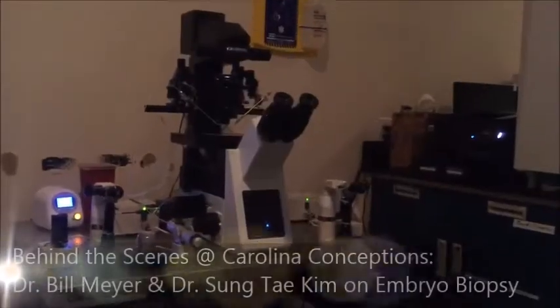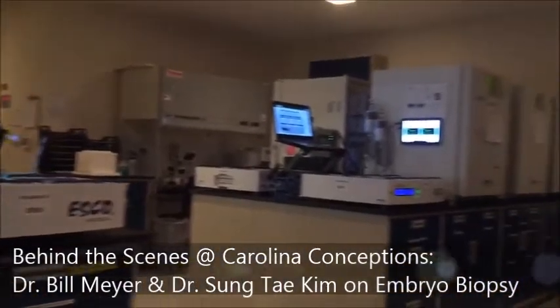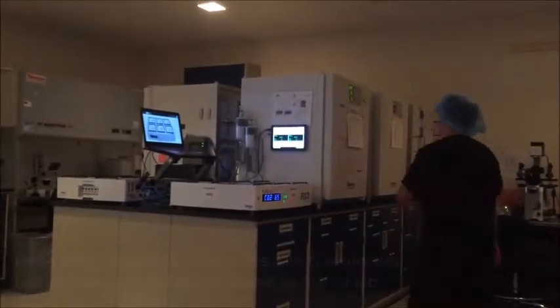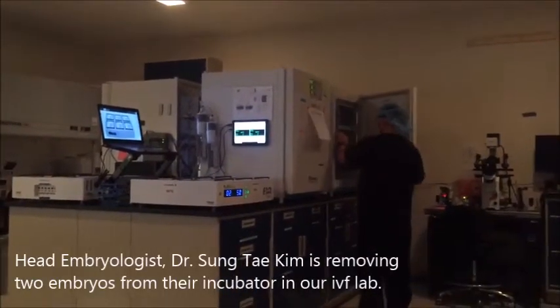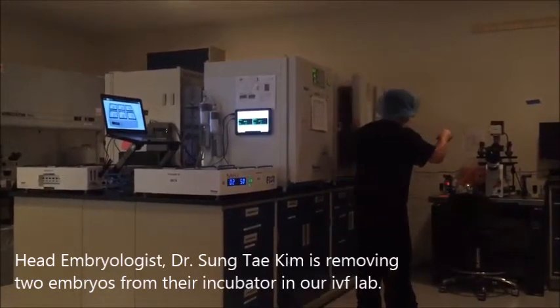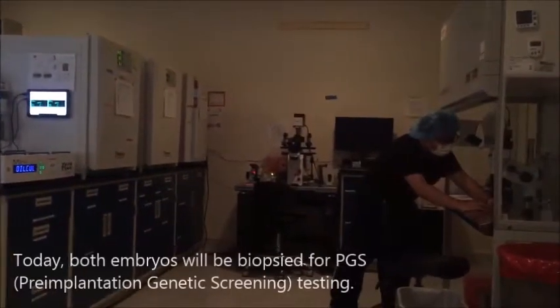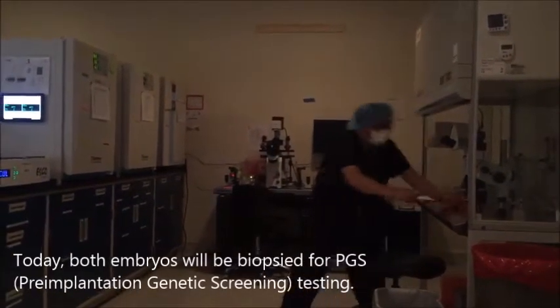This is Dr. Meyer again, here in the laboratory. Dr. Kim is here — he's coming over and looking at the incubator. He's going to take out two embryos and biopsy those embryos today, so he's going to show us how he does that.